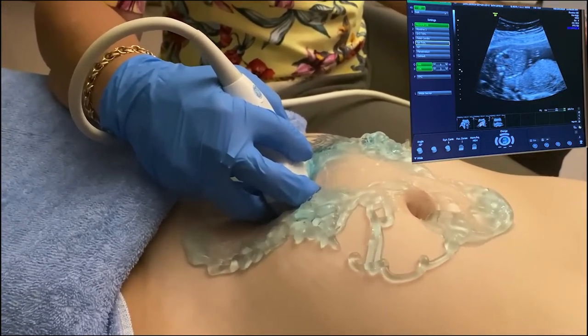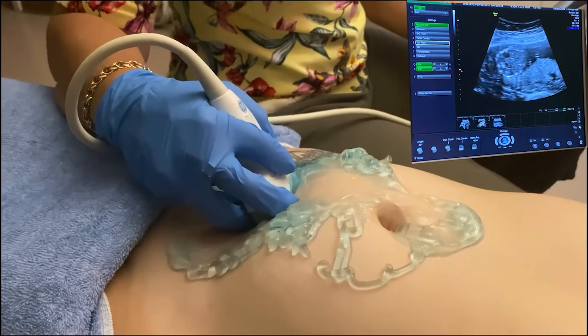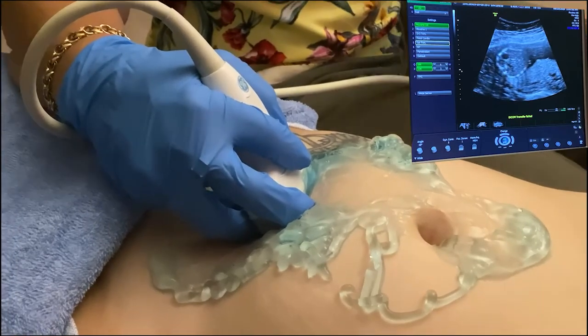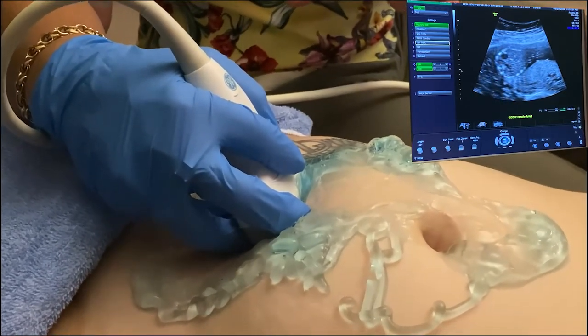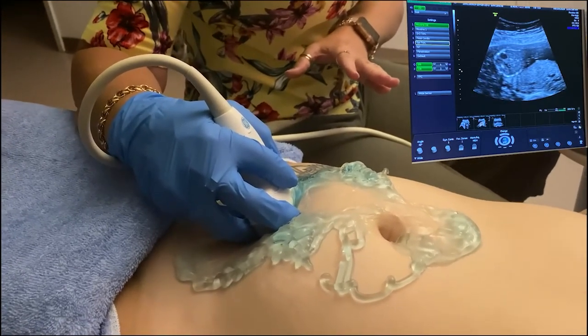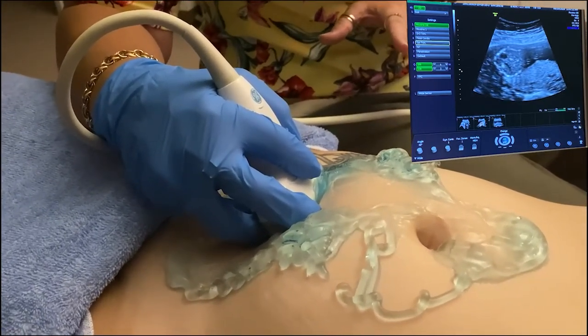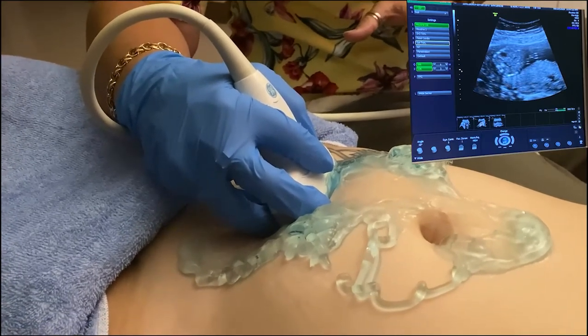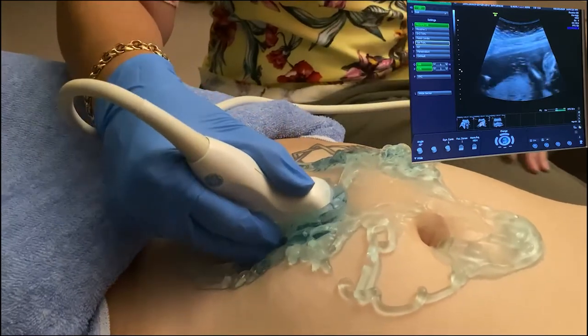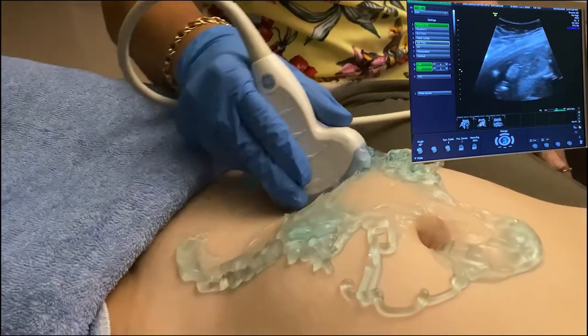And we can go further down, and when I say down, I mean inferior to baby. Now that we have established situs, we know that the baby is laying on its right side with the left side most anterior. So inferior to the fetal heart, I should see the fetal stomach on the left. And here we have. Now we can go to a coronal shot of the baby.